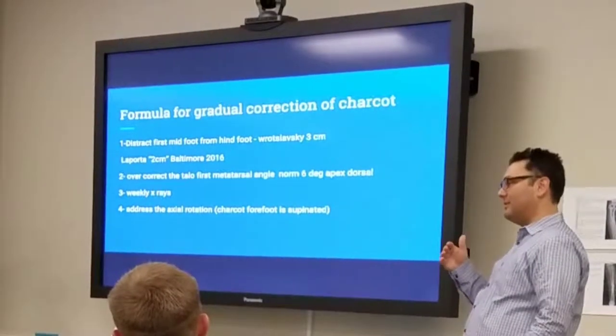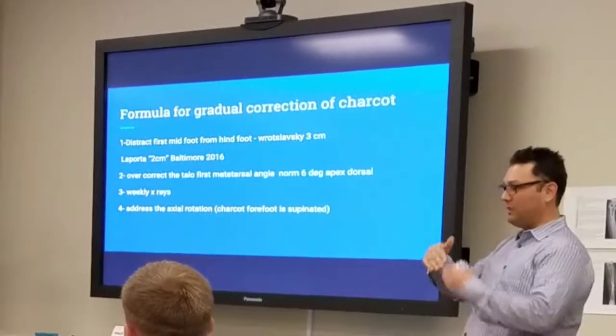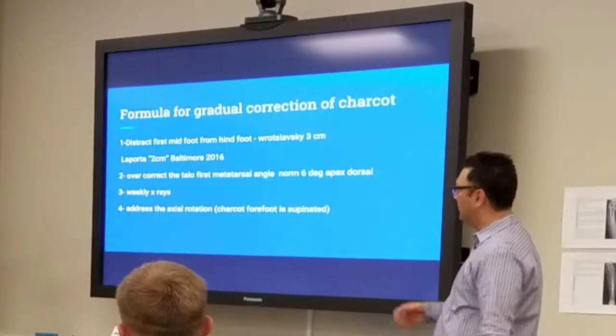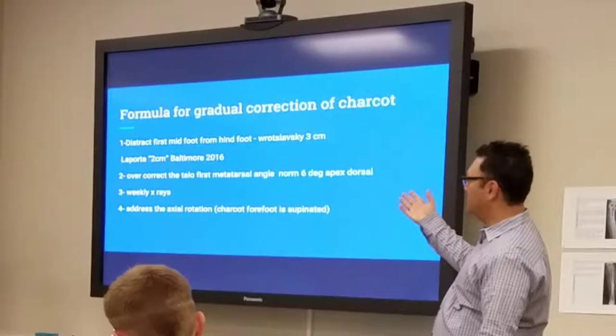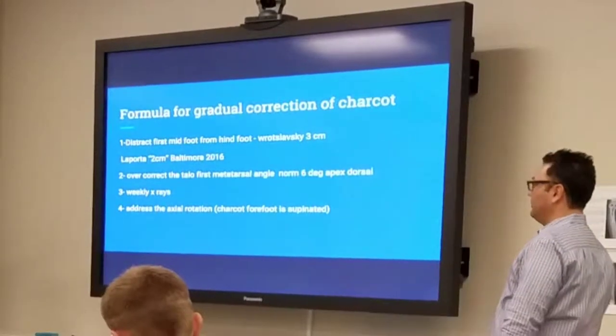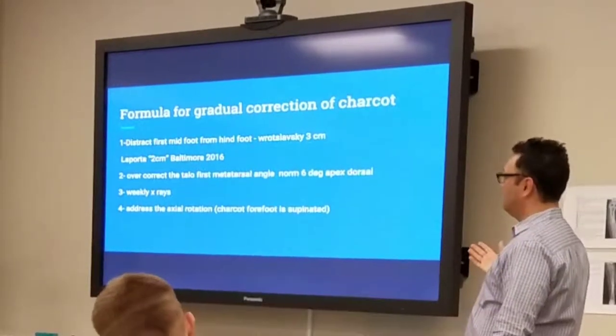That's the whole concept: it's just going to jam on each other if you just try to make a correction. So I like to do 3 centimeters of correction and then back it off. Dr. LaPorta was telling us the saying in Baltimore the other year that 2 centimeters is what he does.